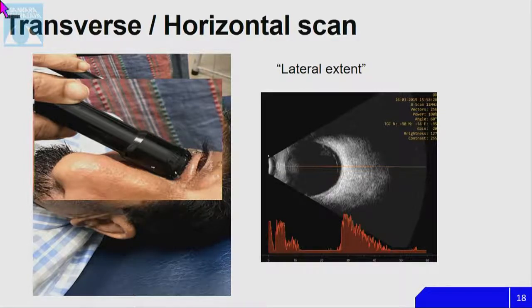So the inferior area that you see is actually temporal. The superior belongs to the mark, wherever the mark is. If your mark is superior, then you are seeing superior in the upper edge of the image, and the lower will be inferior. Yes, ma'am.